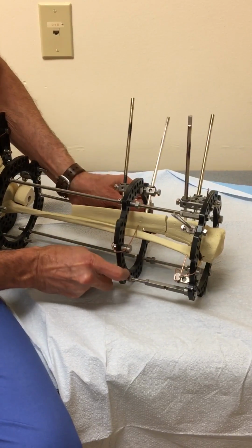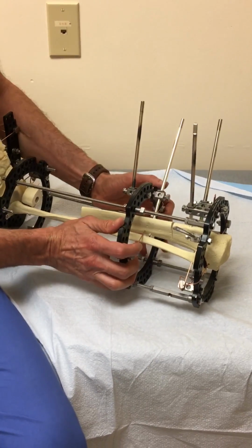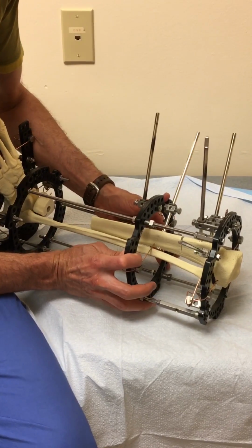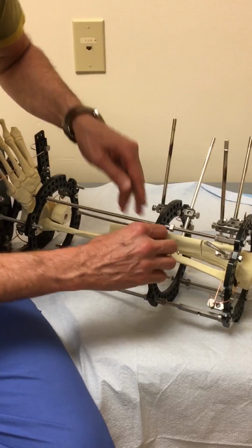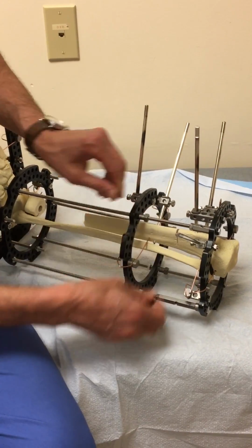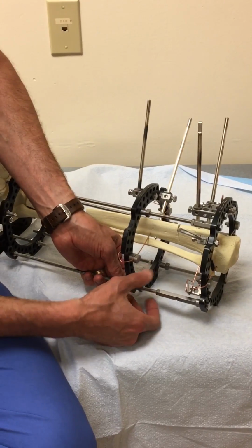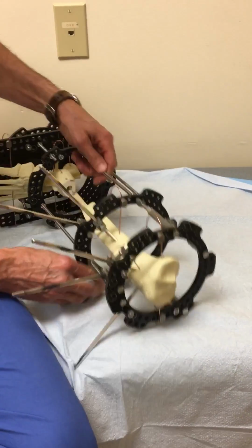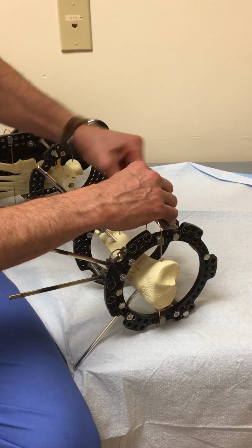So after you're going to have this frame on, you'll cut the bone and you'll be able to loosen things up to make sure that the bone's cut all the way through, okay? And before you leave the OR, you want to tighten these back so that the osteotomy is being compressed together for about 10 days, at least 7 days, but somewhere around 7 to 10 days is the norm. So now I'm just tightening these up.